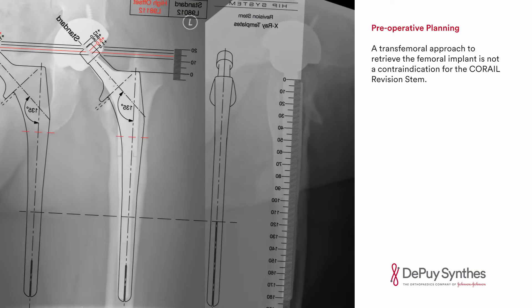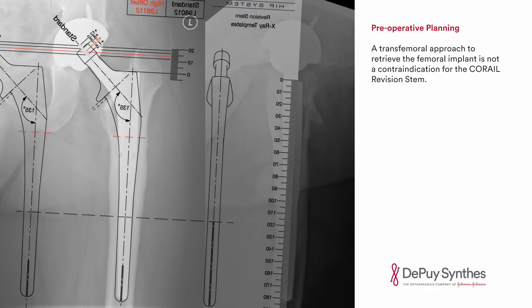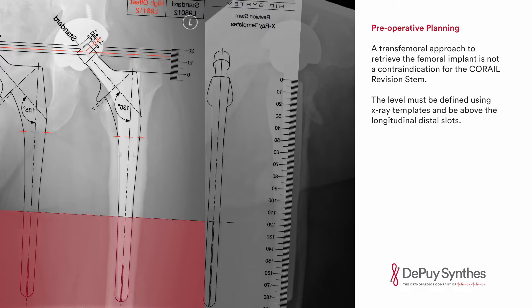A transfemoral approach to retrieve the femoral implant is not a contraindication for the Karai Revision Stem. The level must be defined using X-ray templates and be above the longitudinal distal slots.